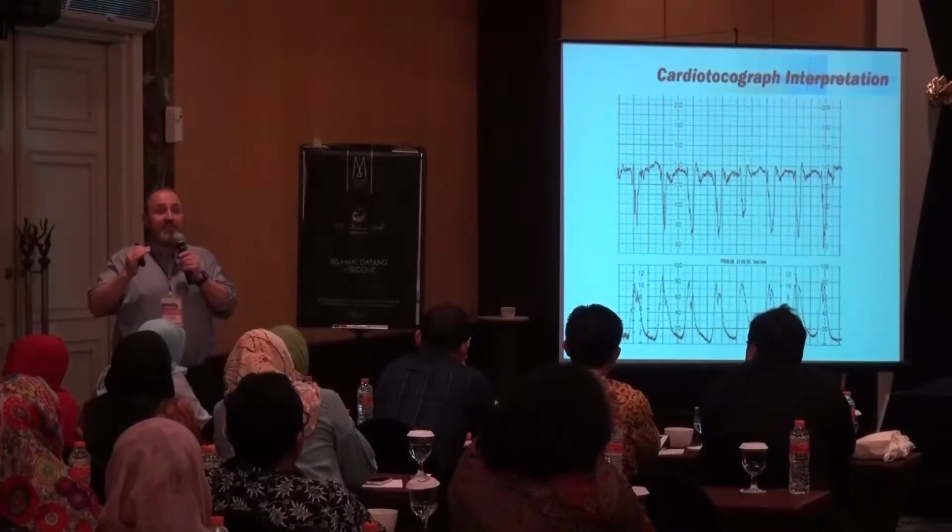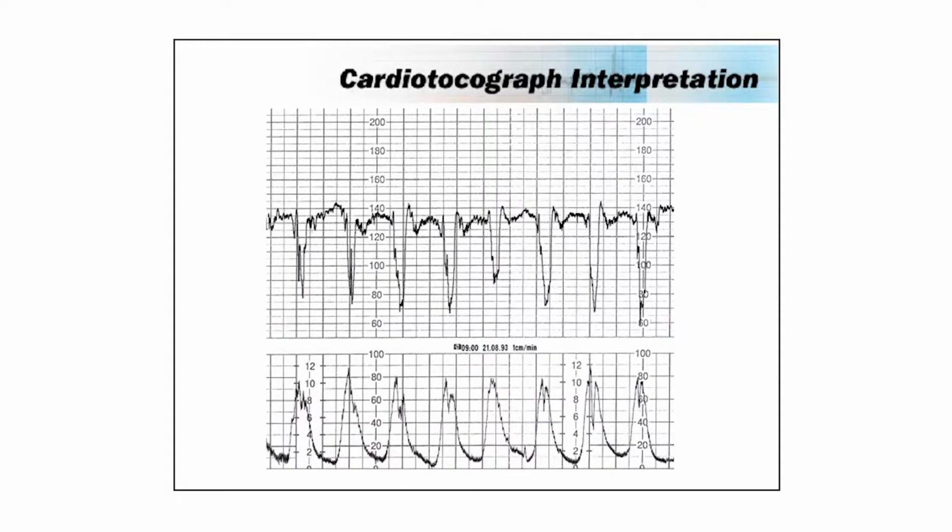This next slide is the one I want to show you, because I certainly know in the countries I have been to, some people, not necessarily here, would often have interpreted this next tracing as earlies. And I'm making the argument it's not. They are variable. I just want to check that you are comfortable with that. Is that okay? Please tell me if you think I'm wrong. These are sometimes called earlies. Can you all see that?